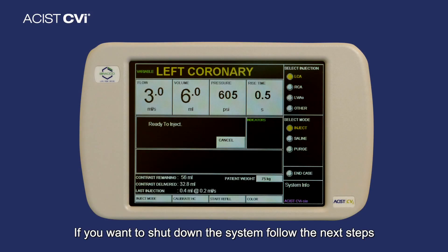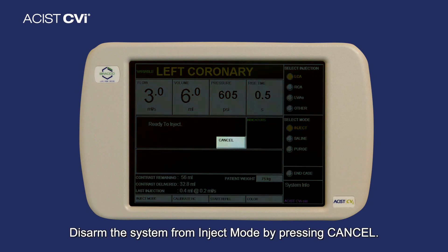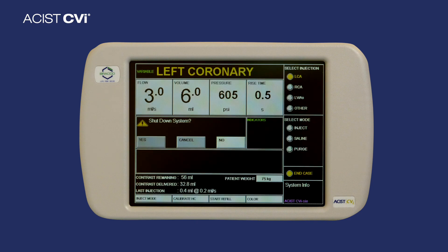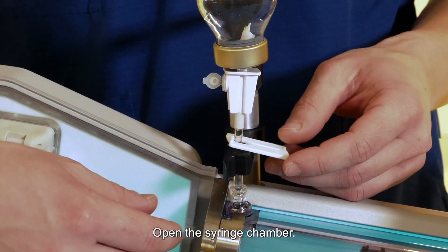To shut down the system, follow the next steps. Step 1: Disarm the system from Inject Mode by pressing Cancel. Step 2: Press End Case, then OK. Step 3: Select Yes when prompted to shut down.